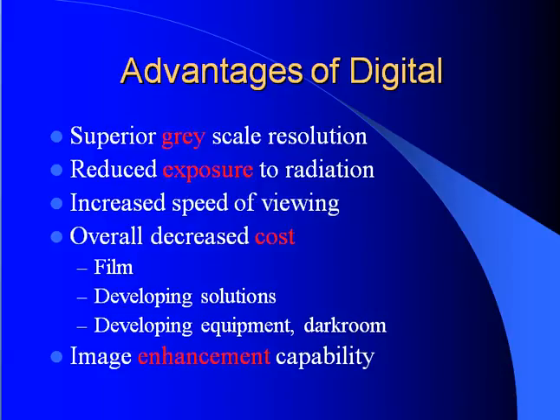The advantages of digital radiography are the superior grayscale resolution that can be attained. It also reduces exposure to radiation on the patient. It has an increased speed of viewing, overall decreased cost for film, developing solutions, and developing equipment, and most digital software allows for image enhancement.